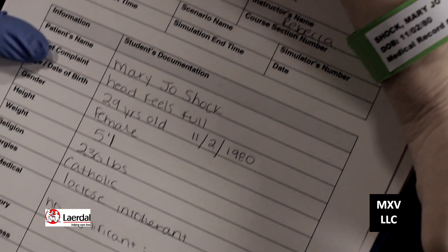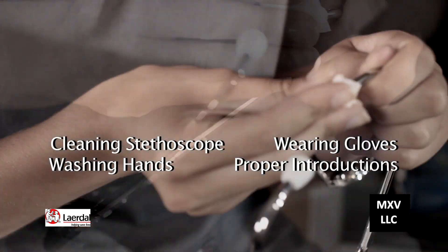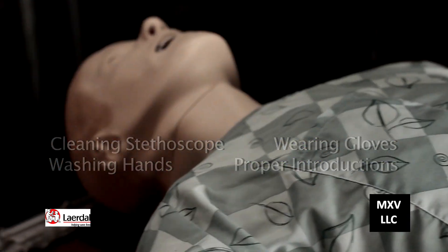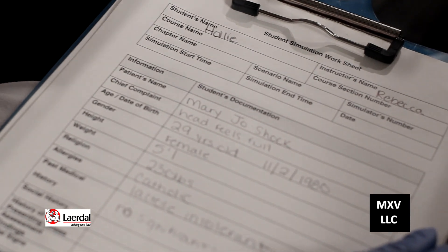Along with the essential clinical skills, your instructors will be looking for the mandatory cleaning of your stethoscope, washing your hands, wearing your gloves, and demonstrating a proper introduction to your patient, including checking the patient name and birthday on the ID bracelet with that on the medical records. Now let's join our healthcare professional Rebecca and her student Holly as we learn how to take a blood pressure.